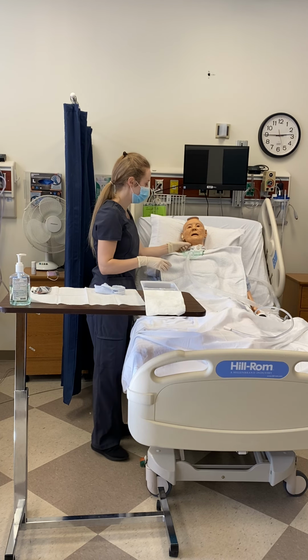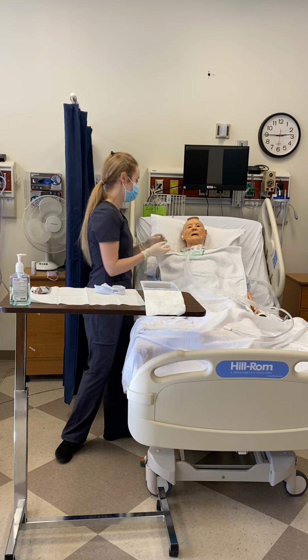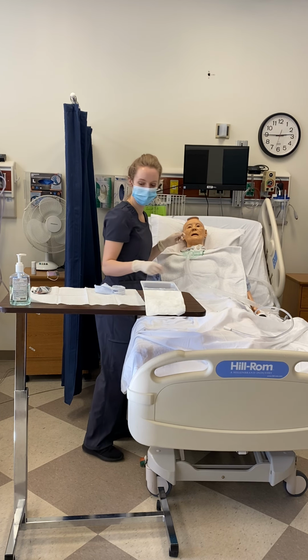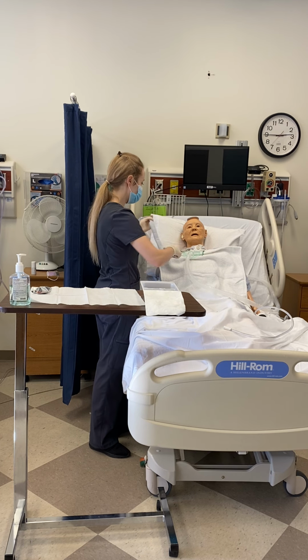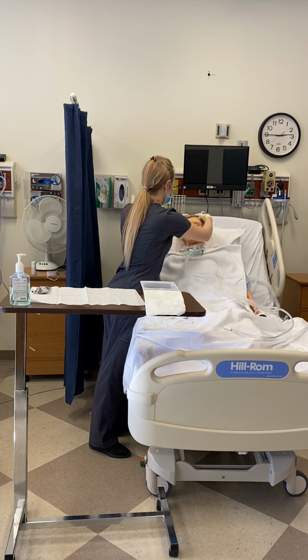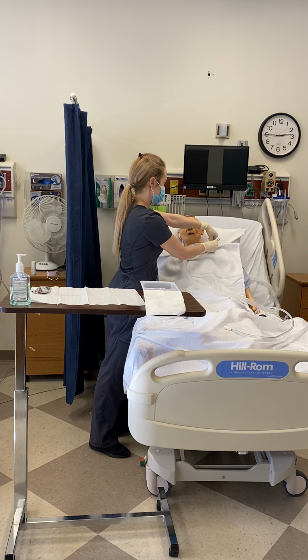So we have a new bandage on there, a new gauze on there, and my last step is to put a new bandage around the trach. And so I'm going to wrap this around the back of Mr. Smith's head first, and I'll just do one side at a time.